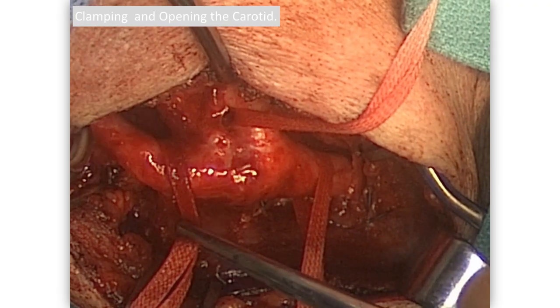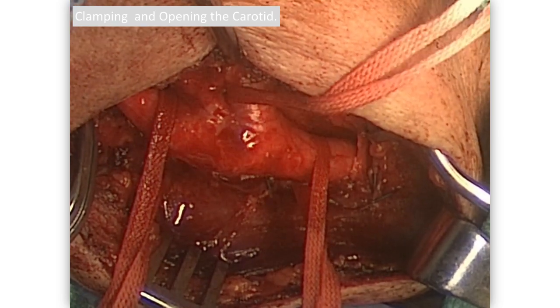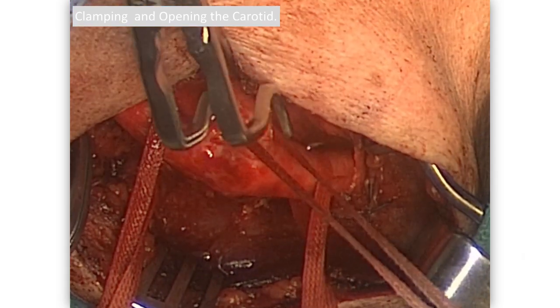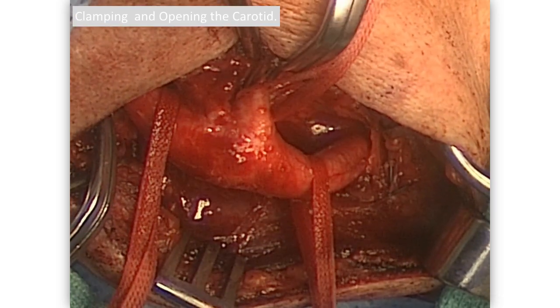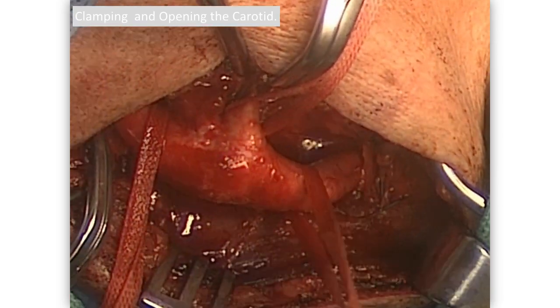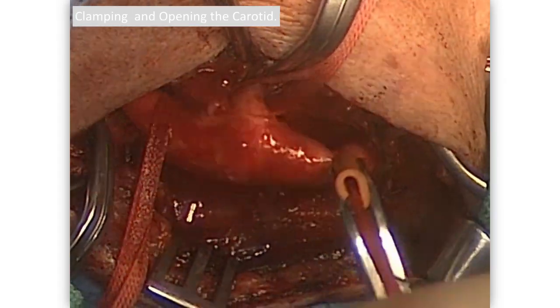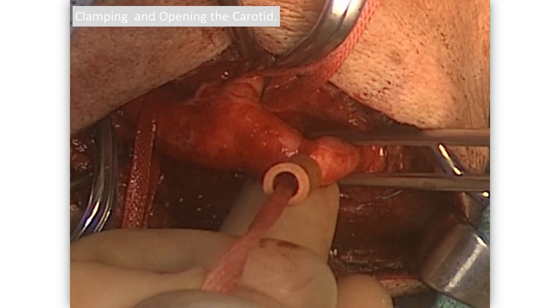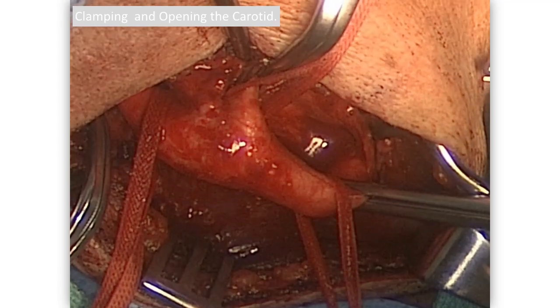Here we pick up at the clamping sequence. Pull down on the internal and put that small Profunda clamp on. Next, the external is going to be clamped. Next, we pick up on the tape of the common carotid artery — sometimes I need to sweep a little more tissue from behind it to give more length. Avoiding the vagus, you clamp, and always clamp proximal to that tape.